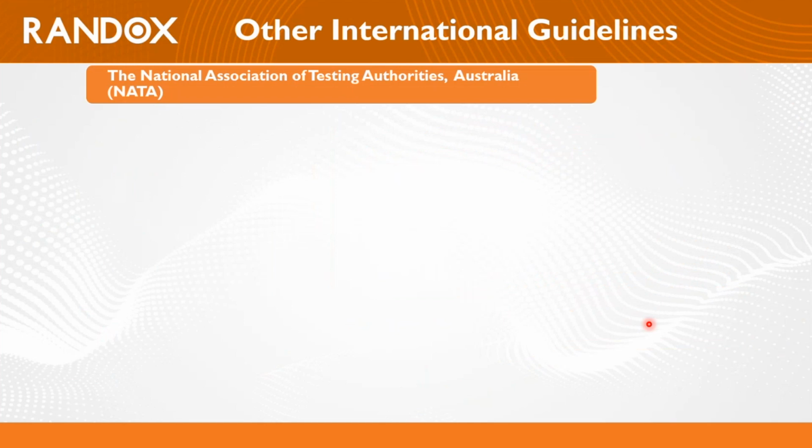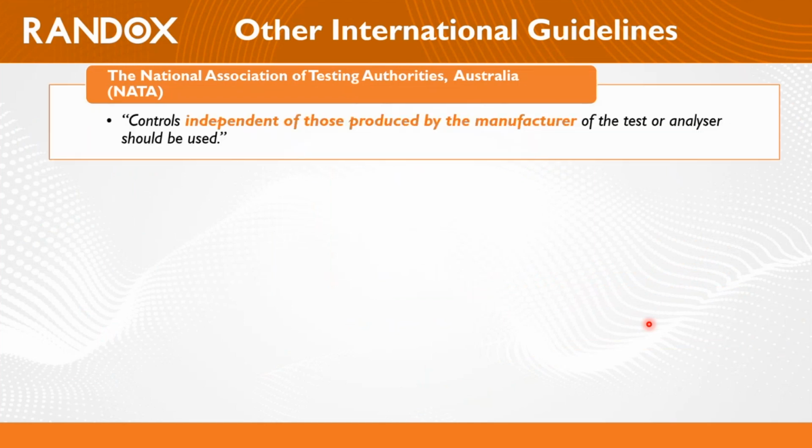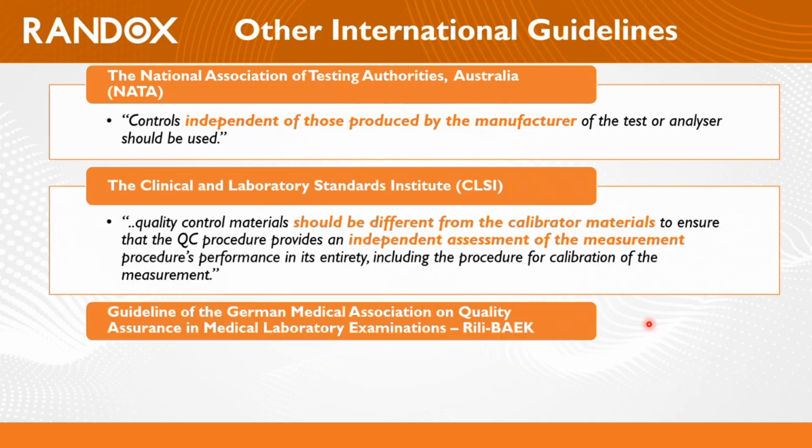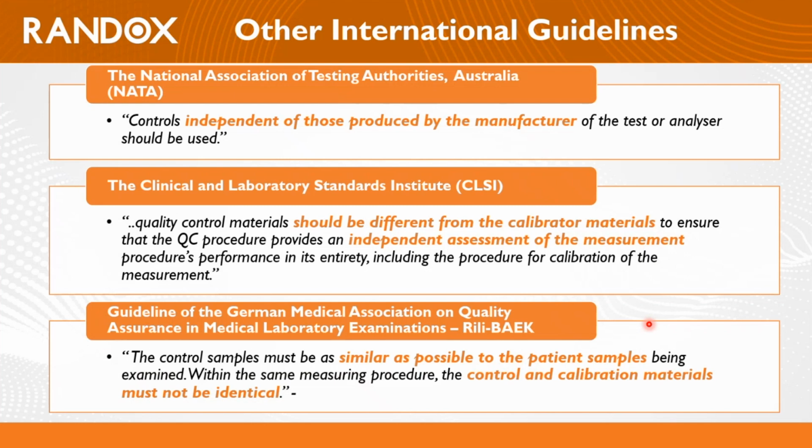Now, there are other guidelines around the world, such as the National Association of Testing Authorities in Australia, CLSI in America, and of course, RiliBAK in Germany. All of them are advocating the use of third-party controls.